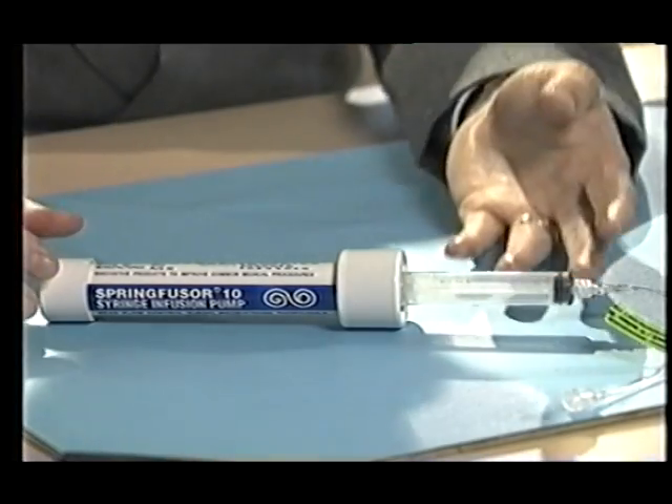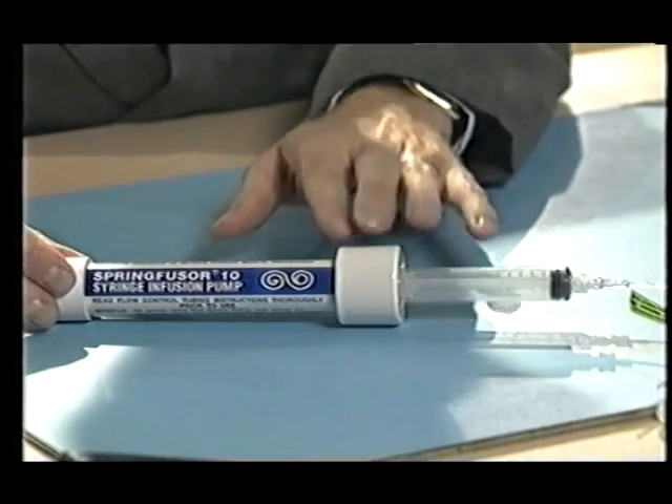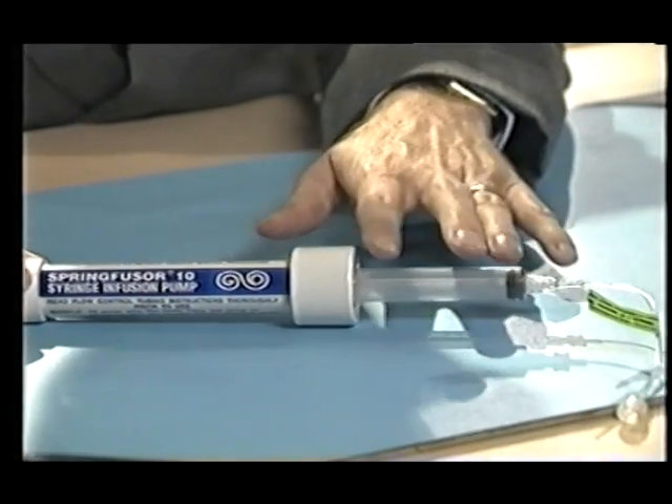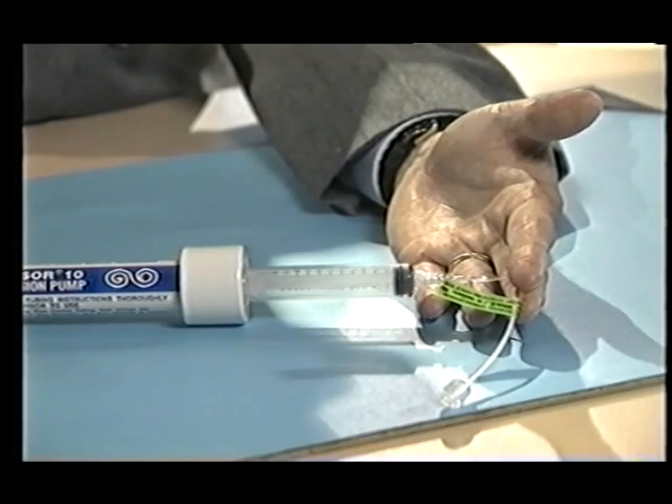The Spring Fuser consists of three basic components: a reusable spring cartridge, a conventional syringe, and disposable flow control capillary tubing.